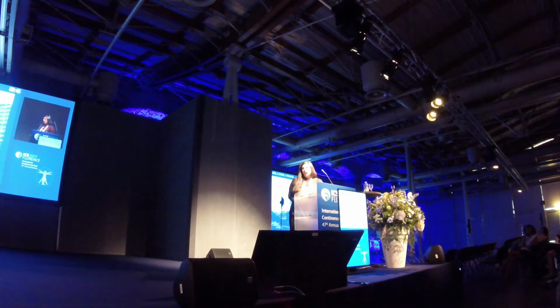I think we have a large cohort of patients that have both urinary and bowel abnormalities, and we found the anterior view of the transvaginal helpful. We can at least look at bladder neck descent initially. You can also pick up a cystocele on this straight away. So then they can go on and be referred. But hopefully we then integrate it all and we'll be able to make a much more rounded conclusion just from the ultrasound.